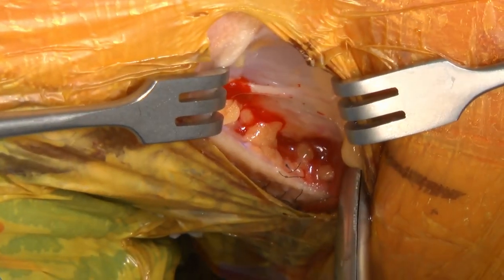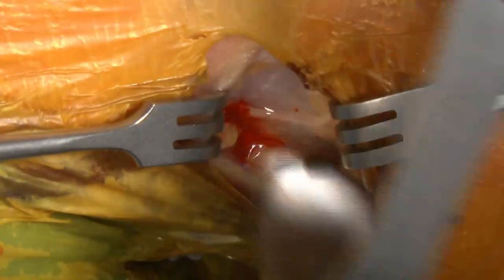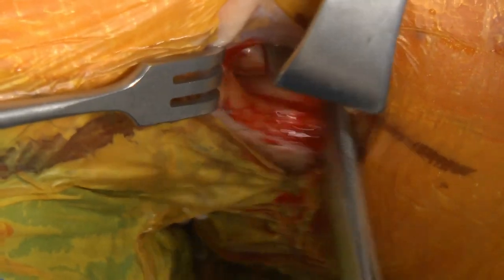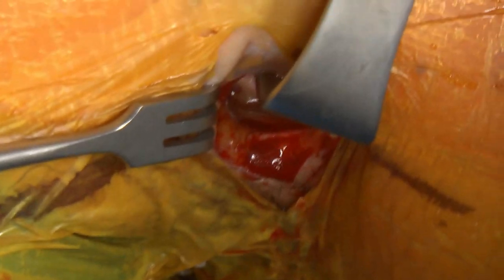So we'll take an Army Navy, and we'll slide this in here, come out with the Senn, and just hold this straight up there, just toe in a little bit. You've got to pull hard with some force.